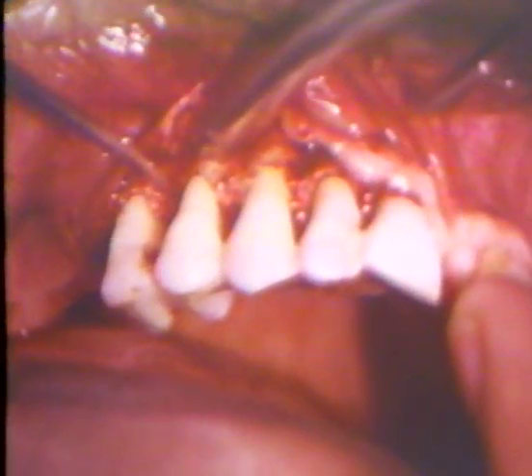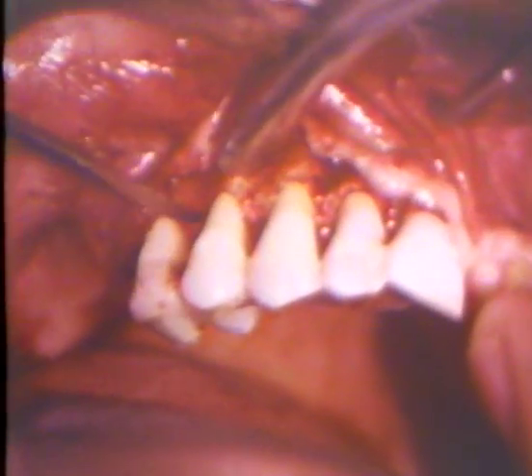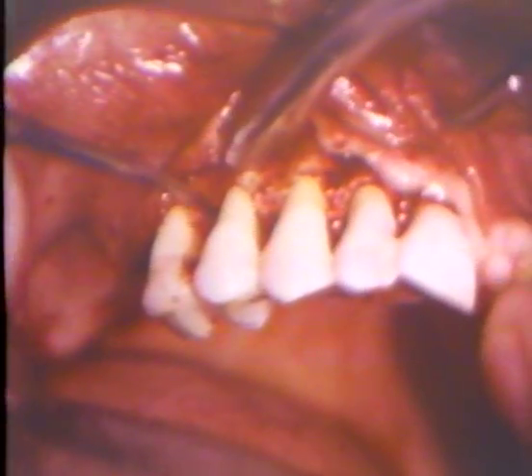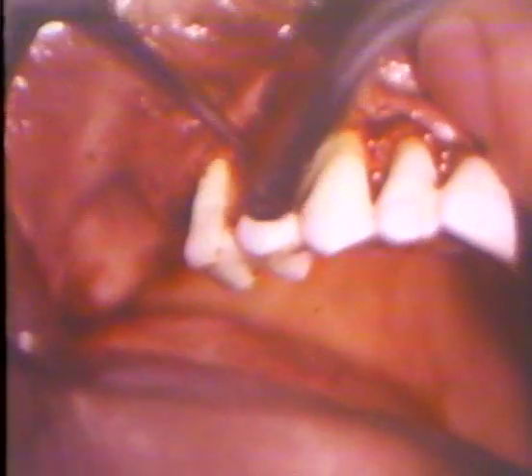With a Sugarman chisel, osseous contouring is accomplished. The double-ended chisels are useful instruments in attempting to create wall depths interdentally. The chisel may be worked from the buccal and go completely through to the palatal aspect. It can also be contoured from the palatal side.